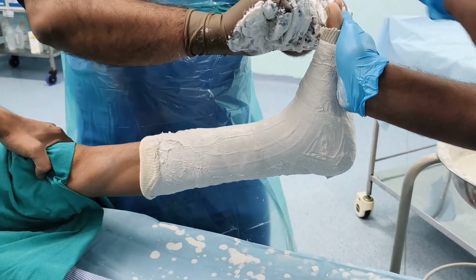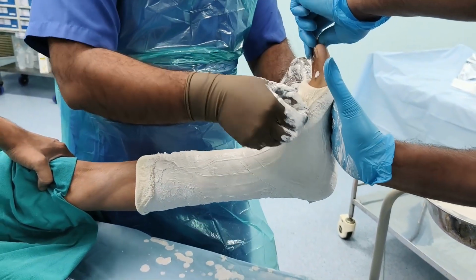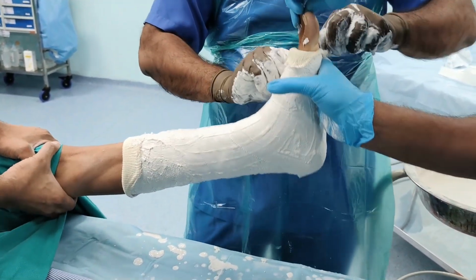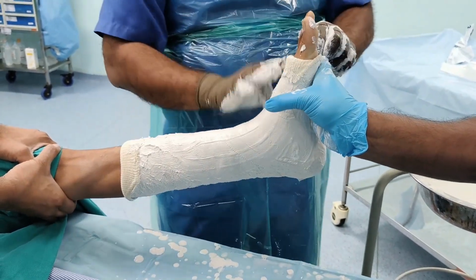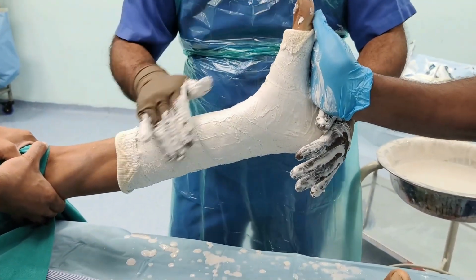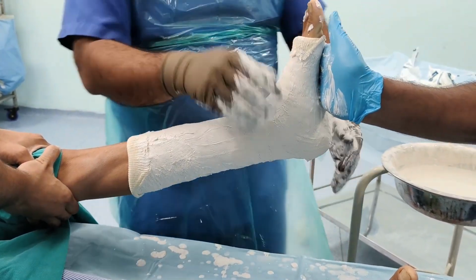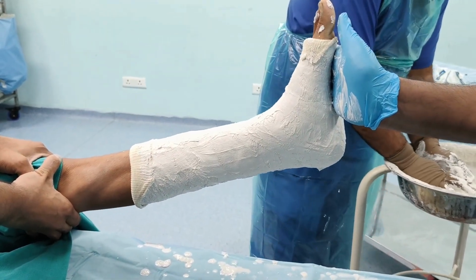Similarly, at the metatarsophalangeal joint also, just hold it and pull it down so that all of your toes are exposed. So I am maintaining the 90 degree at the ankle joint and I have pulled down the stockinette. Now I just have to wrap the last POP bandage and I will get adequate strength which I need.